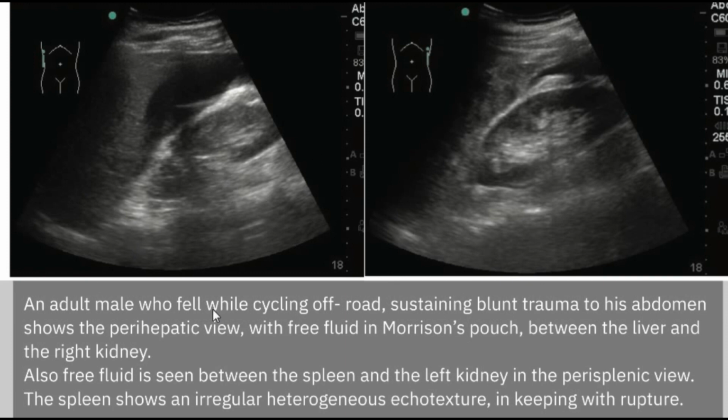Again, we have this patient with a history of blunt trauma to the abdomen, and when we did the ultrasound, we found that there is free fluid, an anechoic area, between the liver and the right kidney, so in the Morrison pouch. Also on the other side, between the left kidney and the spleen, we can see fluid around it. Normally we shouldn't see this free fluid.